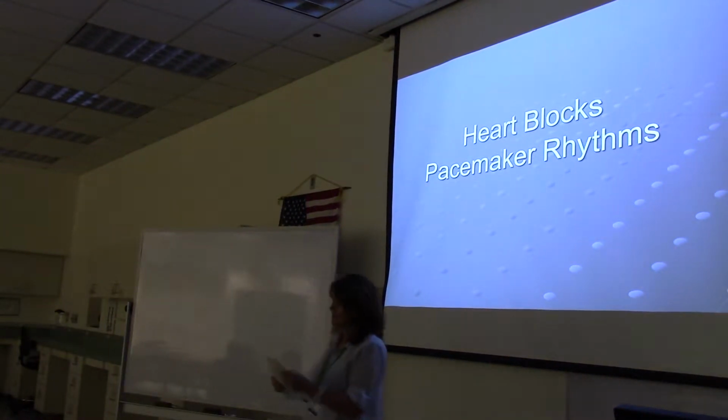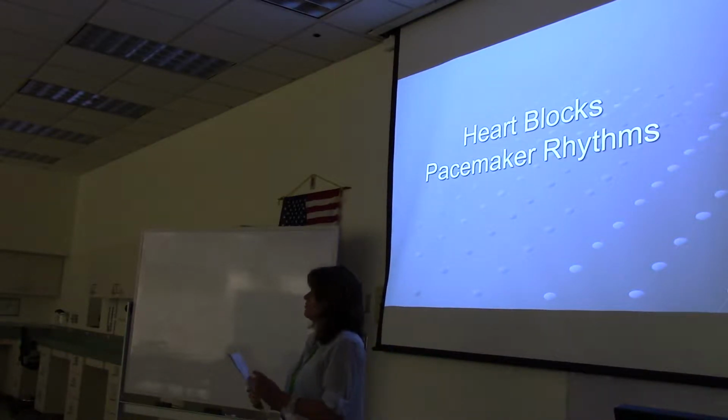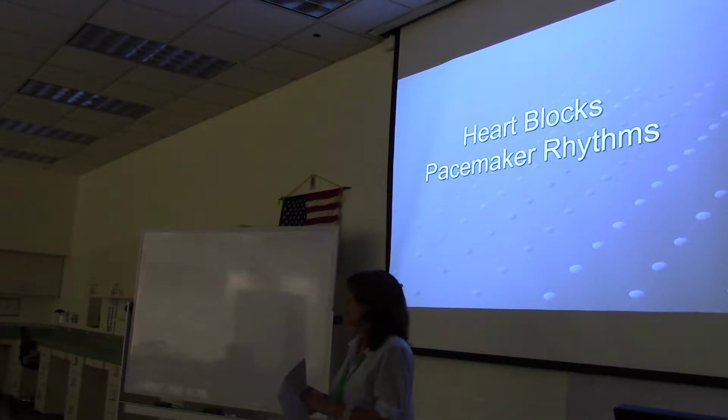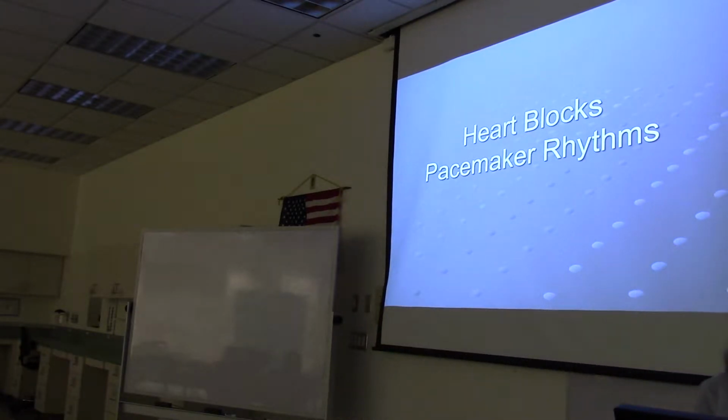We're going to get started on the lecture with heart blocks and pacemaker rhythms. Heart blocks, when it's the first degree and second degree type 1, it's not a serious arrhythmia. However, the rest of the heart blocks are very serious and life-threatening. So it's good to be able to recognize all of those.